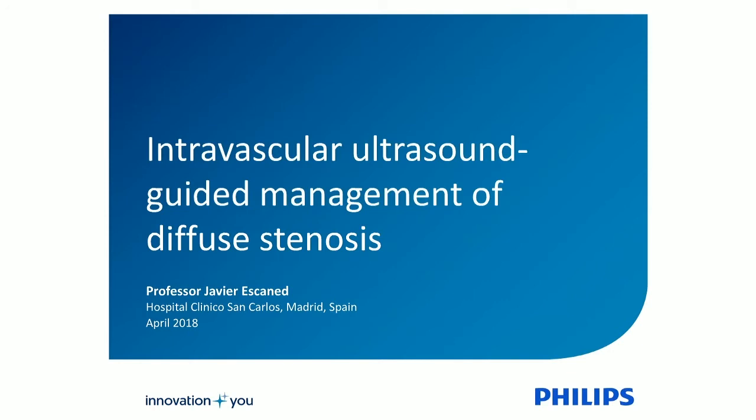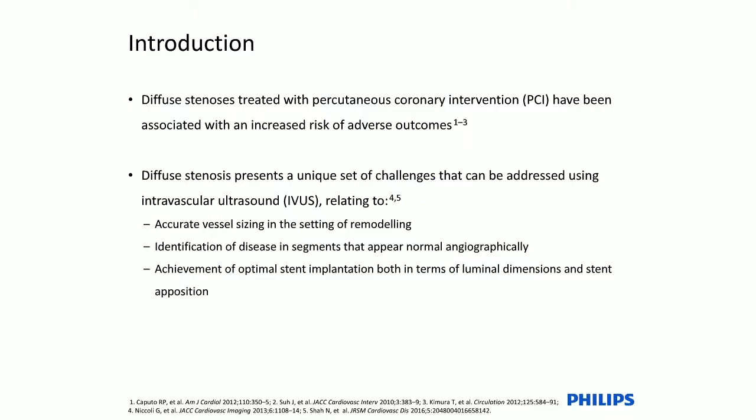Welcome to this webinar on intravascular ultrasound-guided management of diffuse disease. Thank you for the introduction, Chris. As it was mentioned, I think we are dealing with a topic of great interest for all of us who are involved in clinical practice.